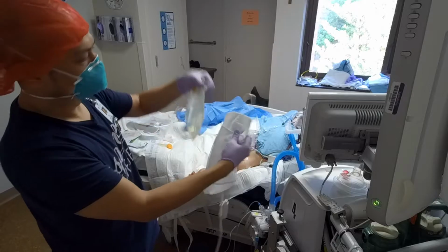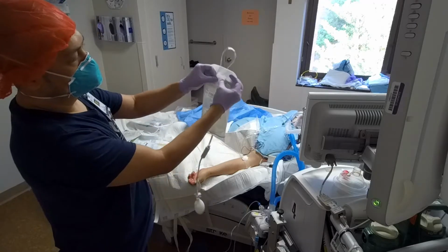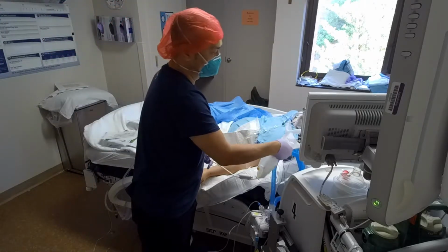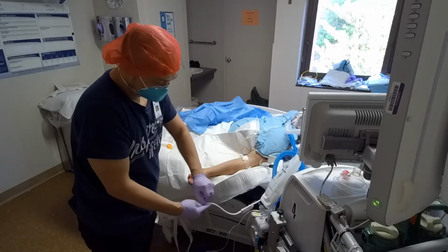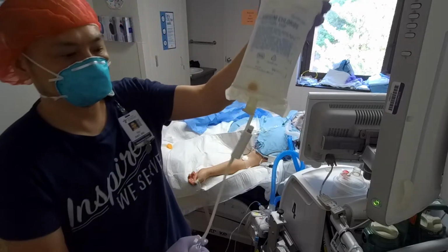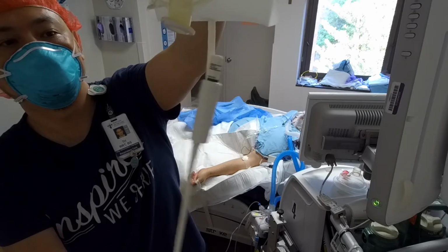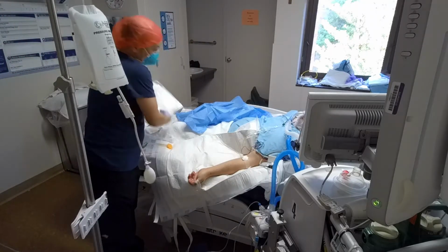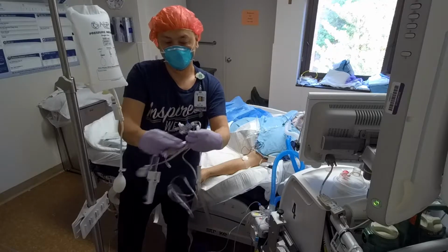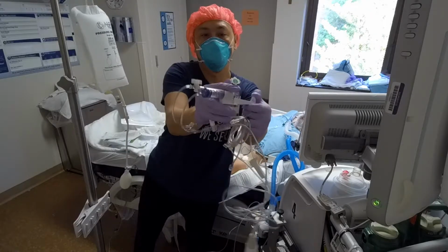A little hook on the pressure bag, put it in, put it on that hook, alright. Hang it right here so I can close it and pump it up into the green. Stop. Alright, now we get our tubing out. Get it all unwound. Remember to push all the air out of the syringe right here. Okay, click.